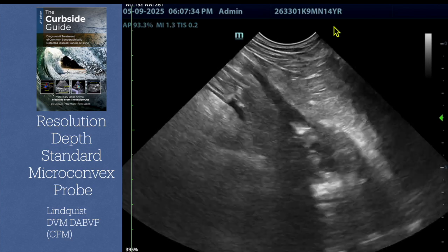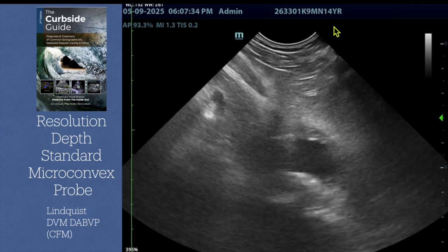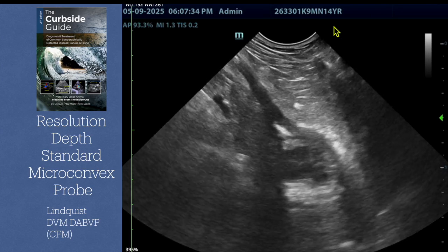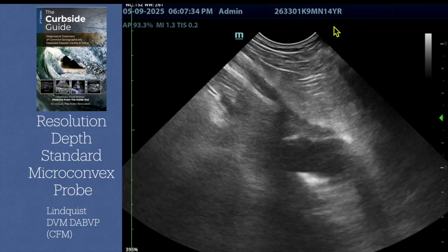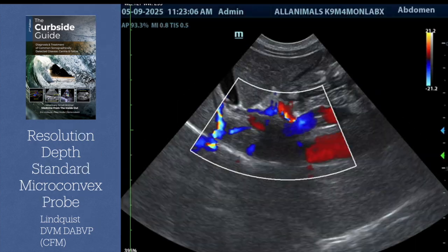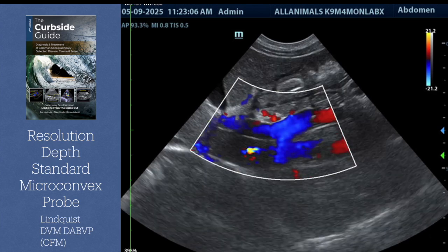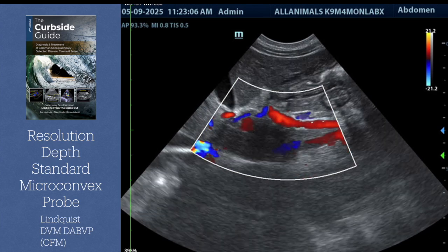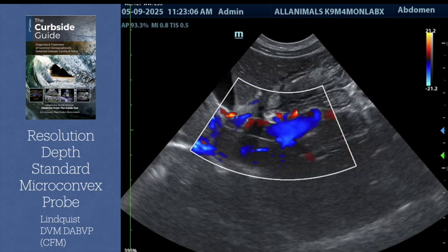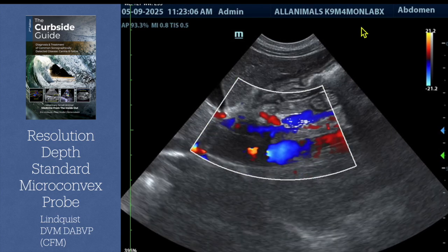So now I take this over to the next machine that's still in play and do the same view and see what happens, right? And then I check the box or don't check the box. Maybe I give it a grade 0 to 5, right, on resolution quality at 6 centimeters. Okay, so let's go to the portal hilus. Okay, this is S-step 11, or you can get there from S-step 13, or S-step 14 with 1 second through 1.5 seconds through the C-loop approach.